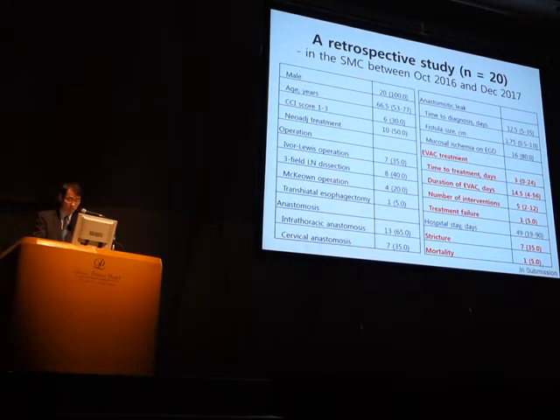Endoscopic vacuum treatment started at a median of 3 days after leak, and the median duration of endoscopic vacuum treatment was 14.5 days, and the median number of required interventions was 5. The success rate was 95%, but one case with a large cavity and a large size leak was unsuccessful with endoscopic therapy and died.